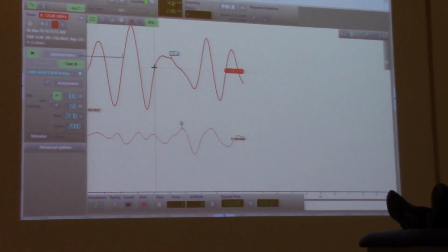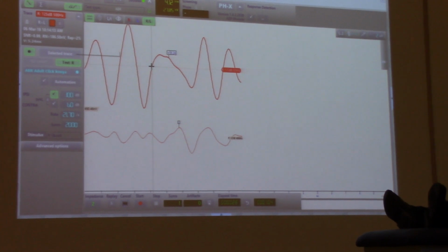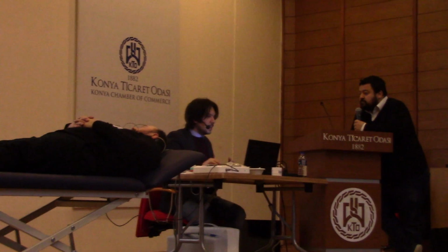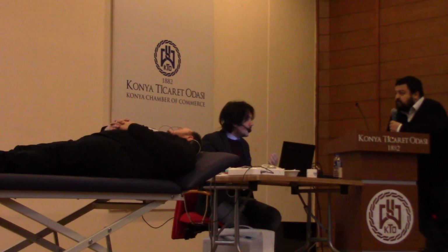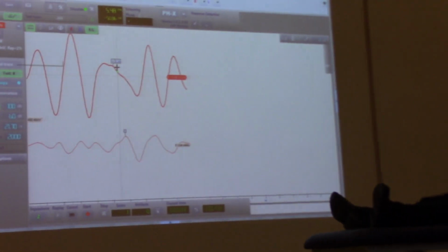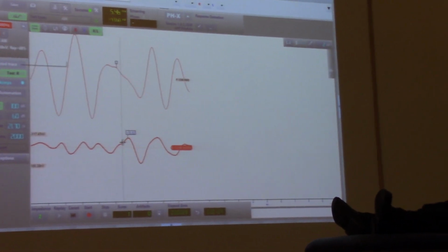Of course, it's smaller, it's normal, because if they are a higher frequency, they move less excitatory cells, but it's quite evident also this latency.